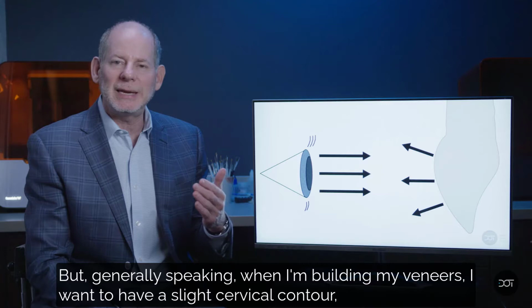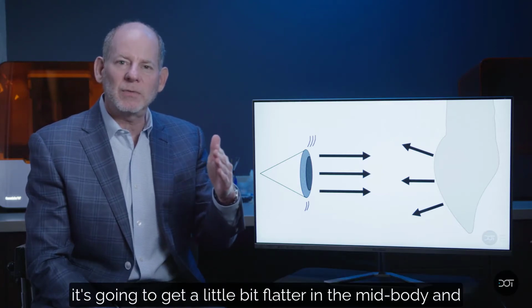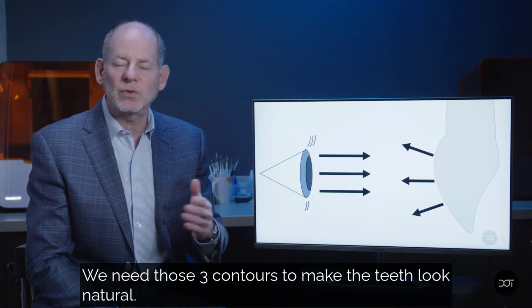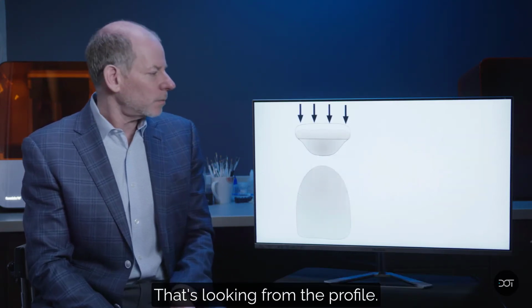But generally speaking, when I'm building my veneers, I want to have a slight cervical contour. It's going to get a little bit flatter in the mid-body, and then we're going to have an incisal contour that's going to come back towards the mouth. We need those three contours to make the teeth look natural. That's looking from a profile.